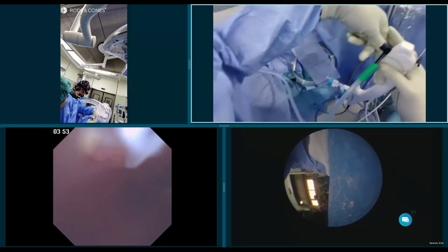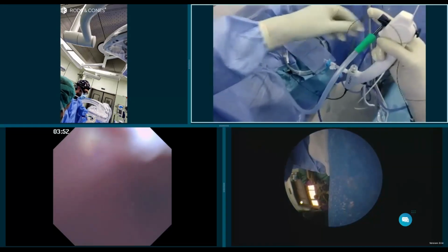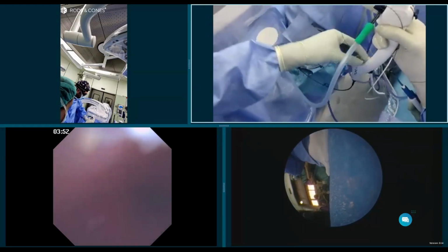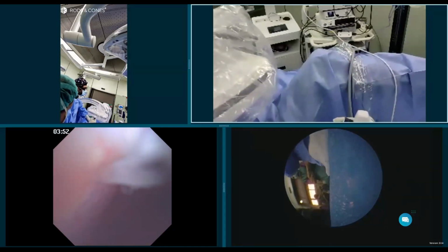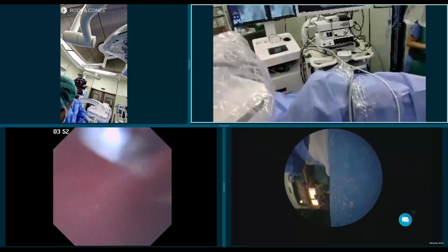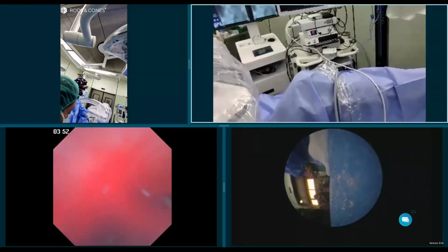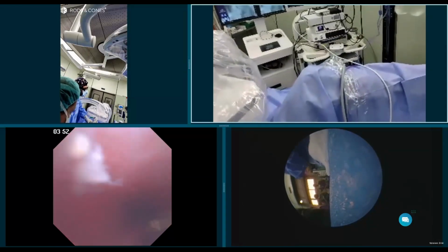Okay, so I'm going to use a very long pulse modulation here, 0.7 joules and 12 hertz. This is good to start. To open here. Great. This is the good thing about having a 3.6 channel with a 1.9 basket and a 200 micron laser fiber. You can put it together.